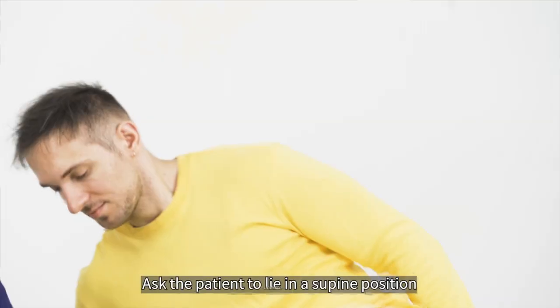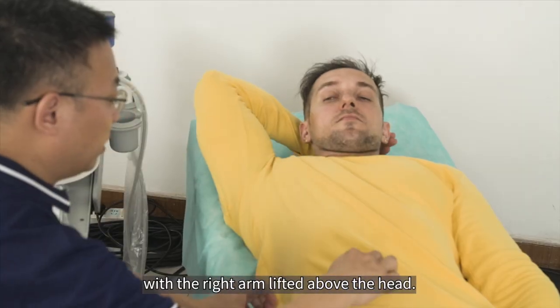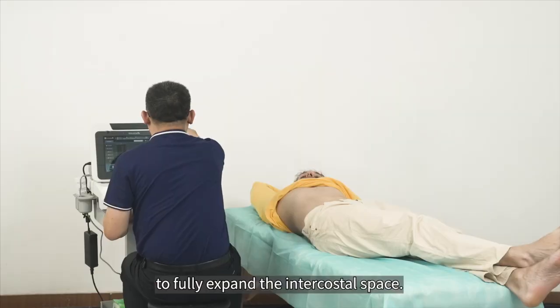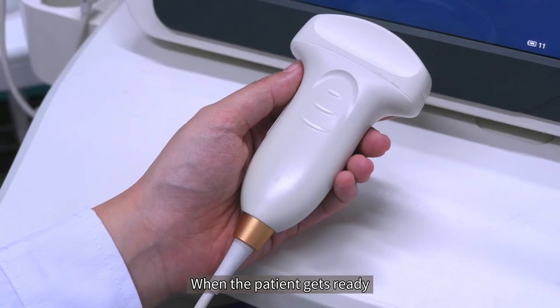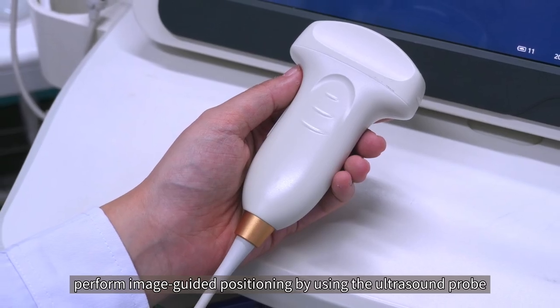Ask the patient to lie in a supine position on the examination bed with the right arm lifted above the head. Bend the body slightly to the left to fully expand the intercostal space. When the patient gets ready, perform image-guided positioning by using the ultrasound probe.